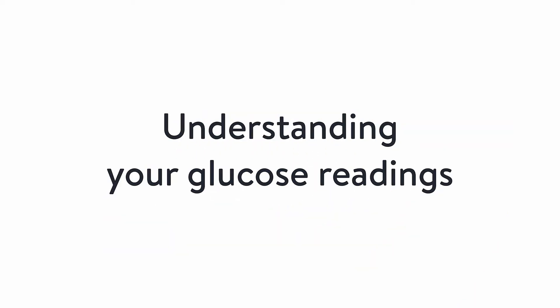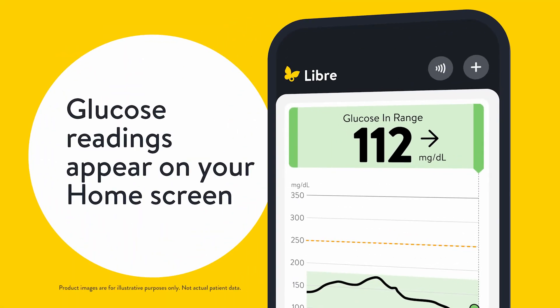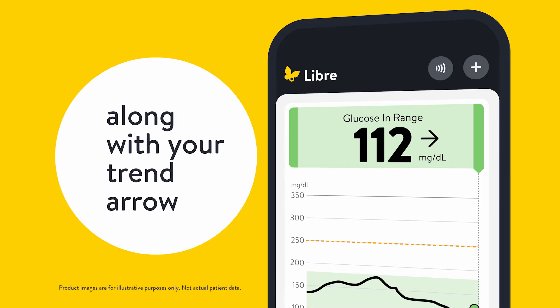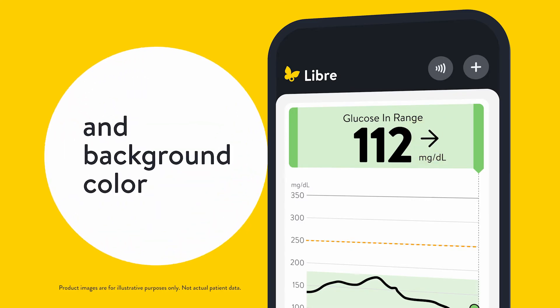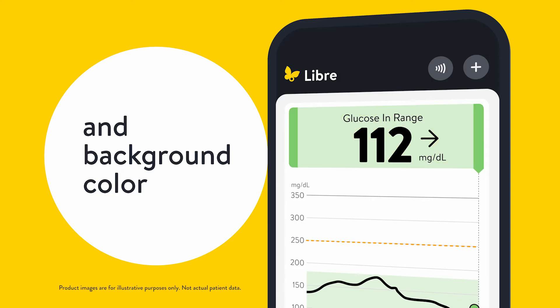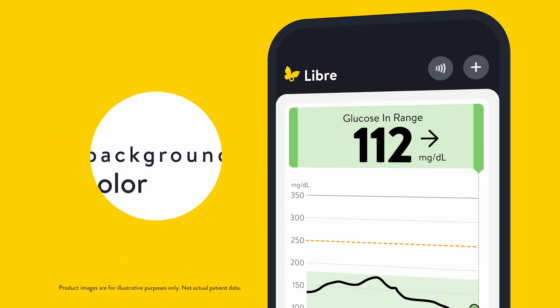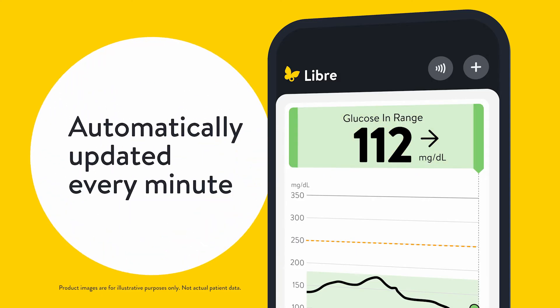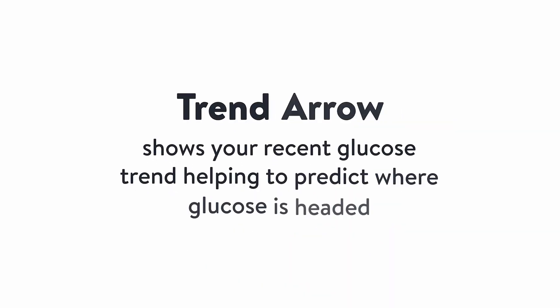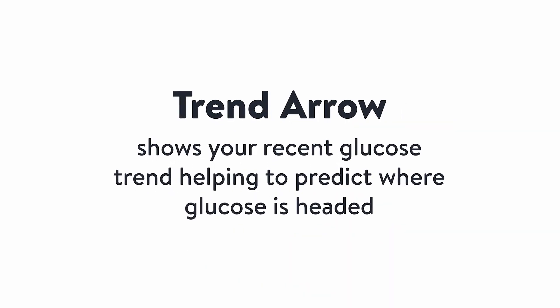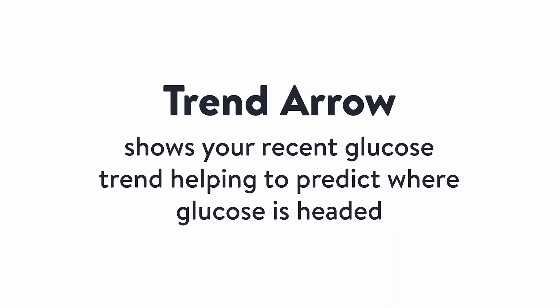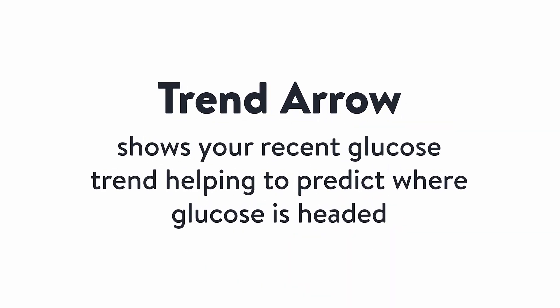Now we'll dive into understanding your glucose readings. Glucose readings appear here along with your trend arrow and background color, and are automatically updated every minute. Your trend arrow shows your recent glucose trend, helping to predict where glucose is headed.